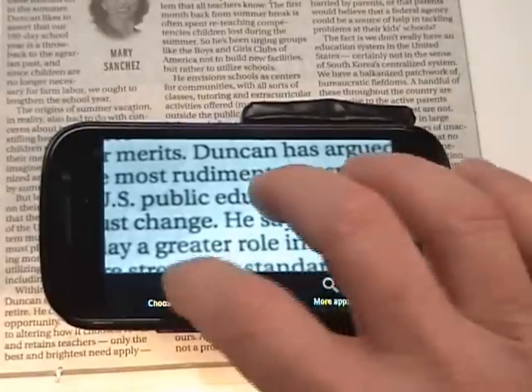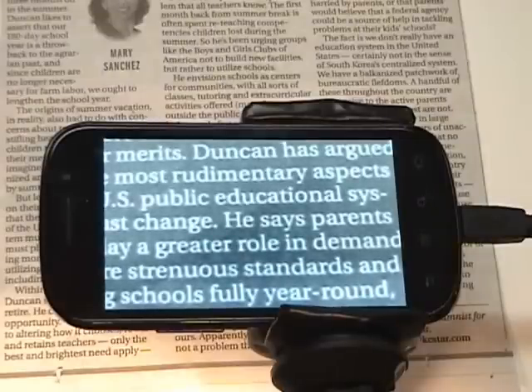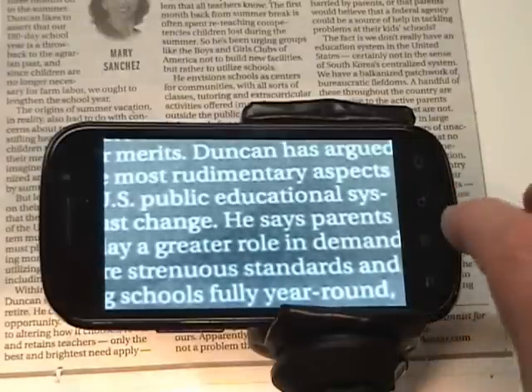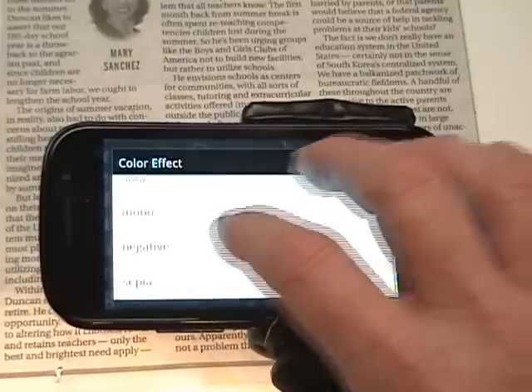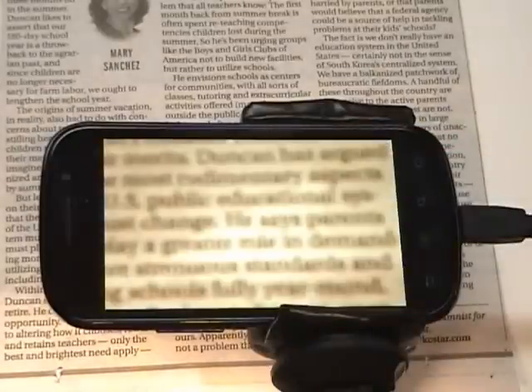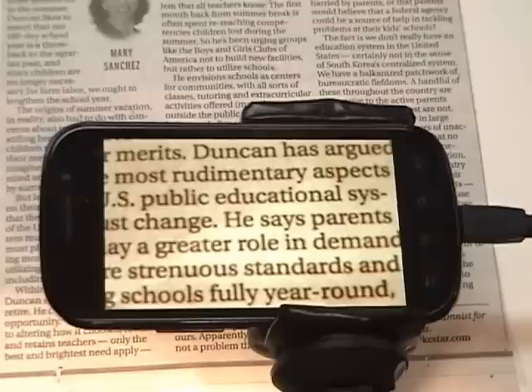For example, I'll tap menu then choose color effect. Let's go to mono — that's the mono effect. We'll now change that again, go into negative — you'll notice the autofocus. And lastly we'll go into a sepia setting. That's the demo of Ideal Magnifier. We hope that it proves useful to a lot of people. Thank you.